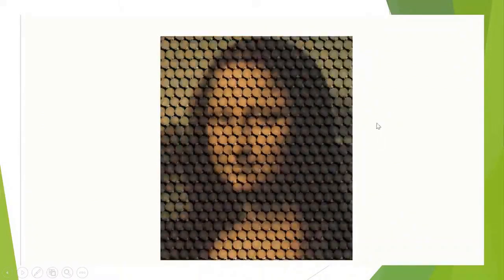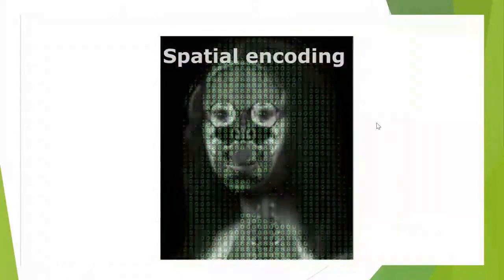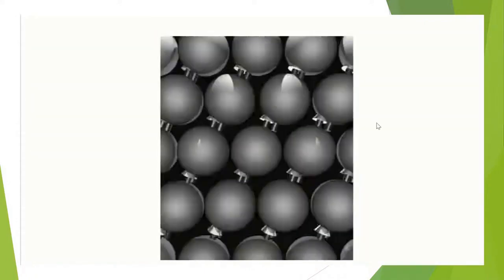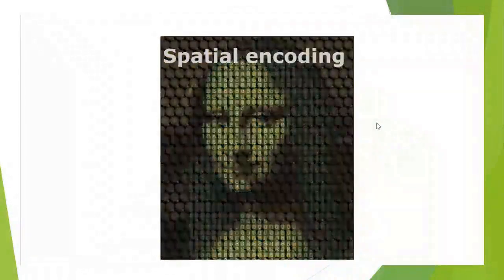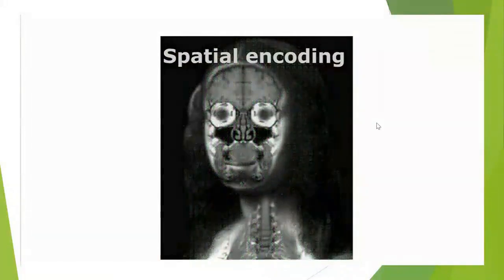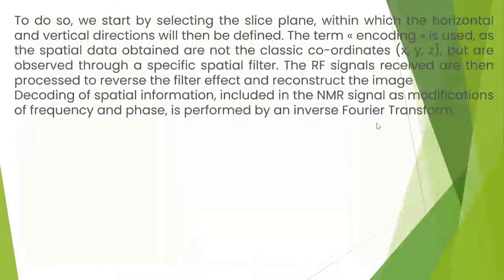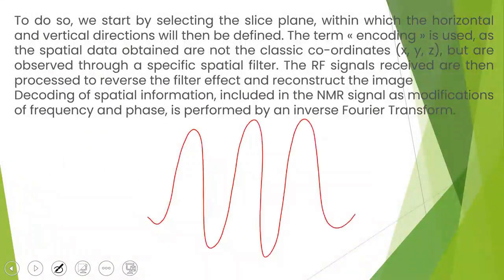You take the signal coming from subatomic particles called protons, record it, and in the end, you get your image, ultimately resulting in your final image. This signal or signals you receive from a patient come at a specific time interval with particular frequency characteristics and amplitude levels. When I say this signal is a sine wave type of signal, this very same kind of signal has its own unique frequency value associated with it. What does frequency mean? It means measuring how often peaks reach their topmost point as well as their lowest bottom.